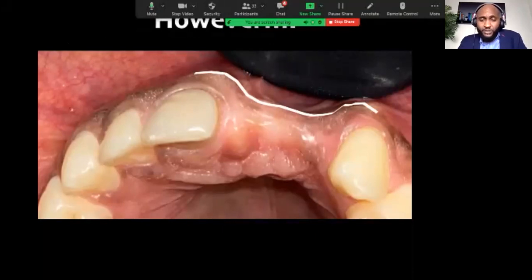Notice the ditching on the back. That flattening there can preclude positioning an implant as you would wish. If you are to follow the bone, then you will not position the implant where it should be. And that forms the basis of our discussion today. What do we do with that defect?